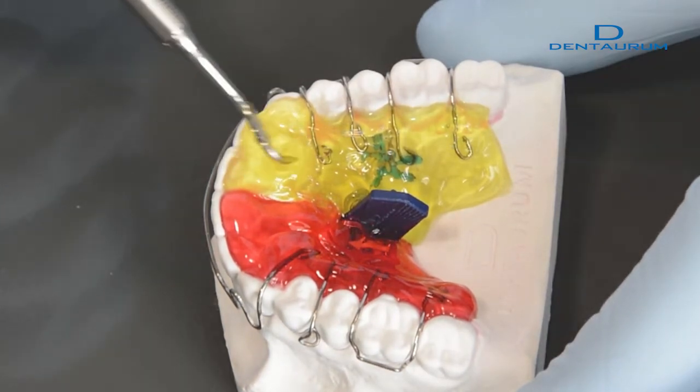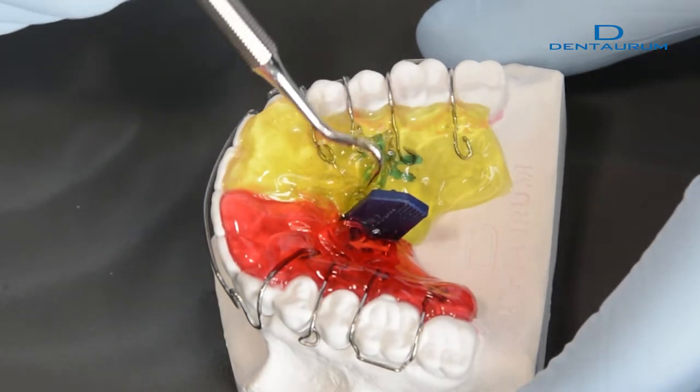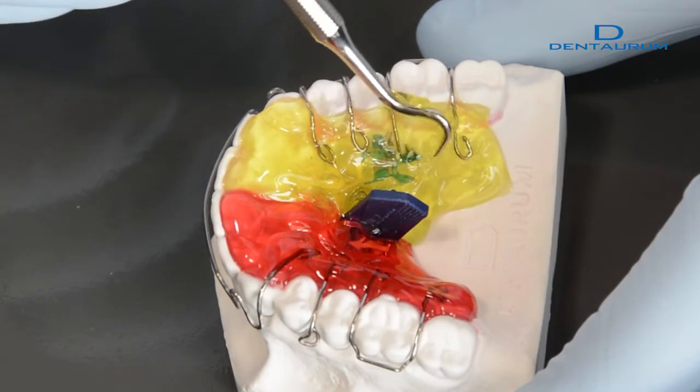The surface can be smoothed out with the help of a sharp instrument. To achieve this, move the instrument quickly to and fro through the acrylic.